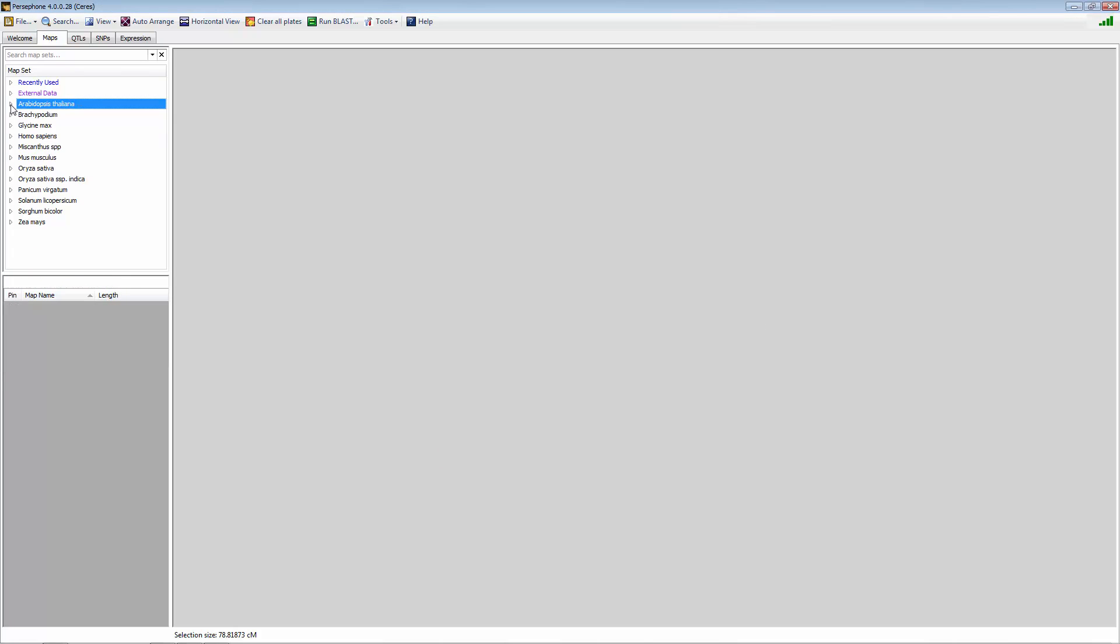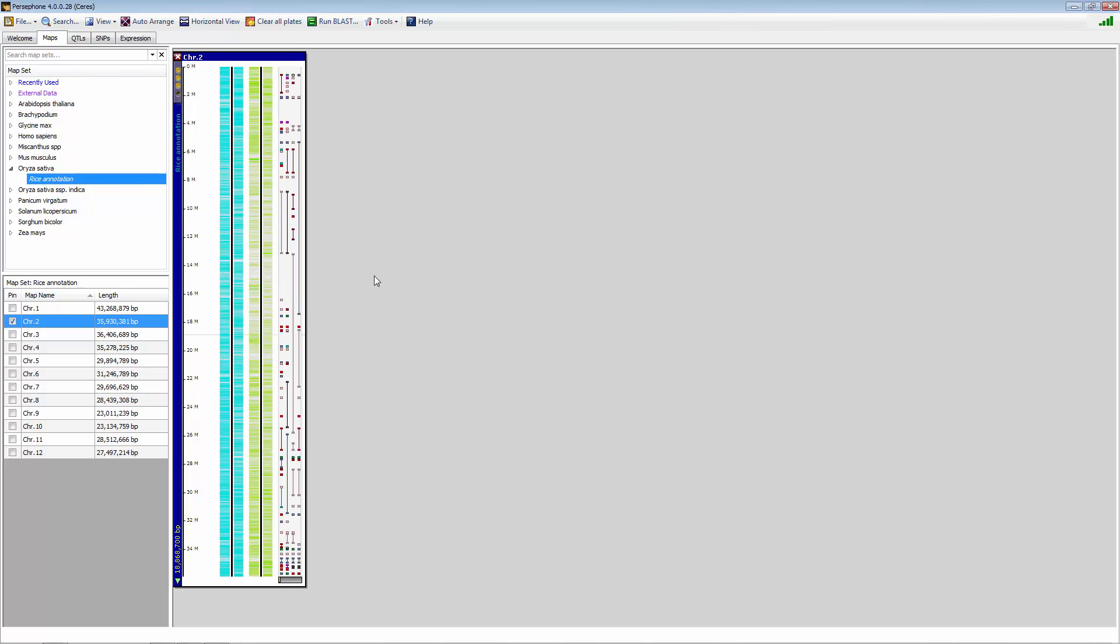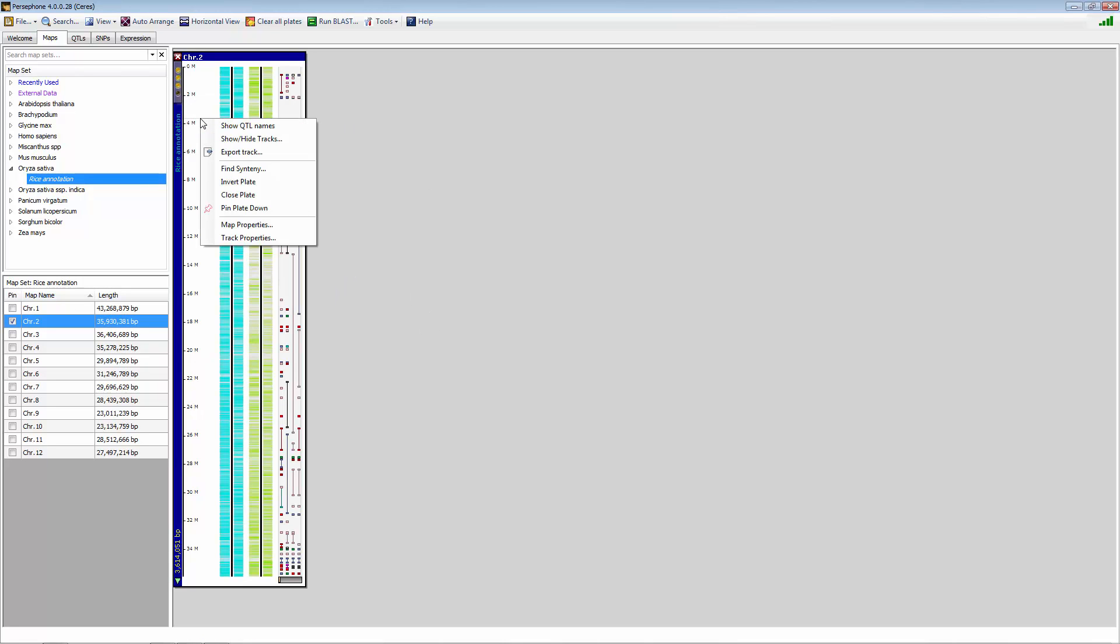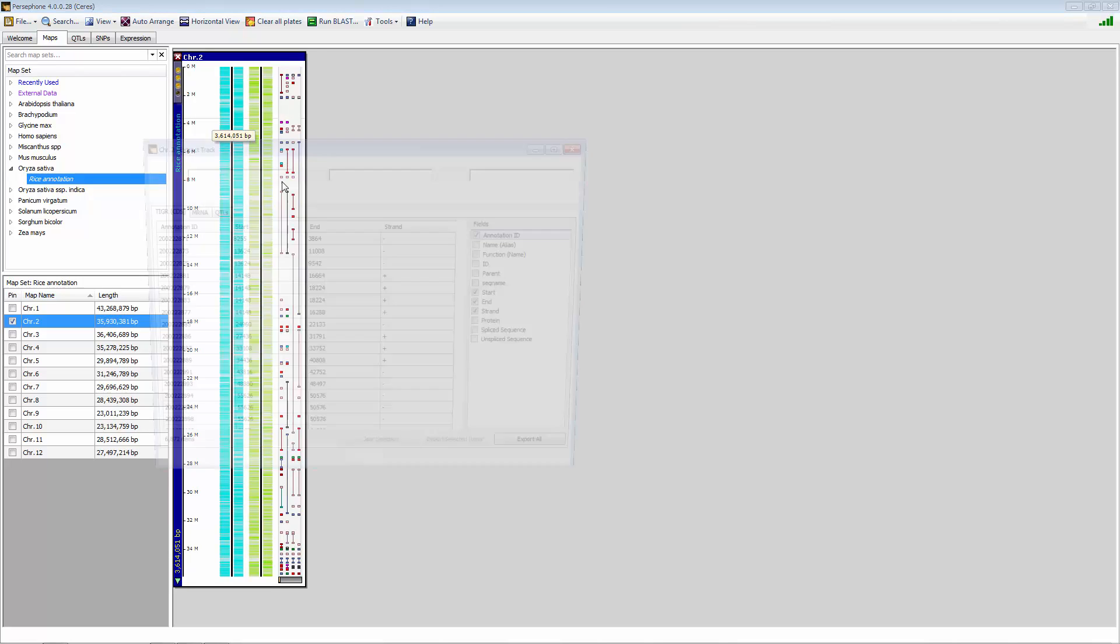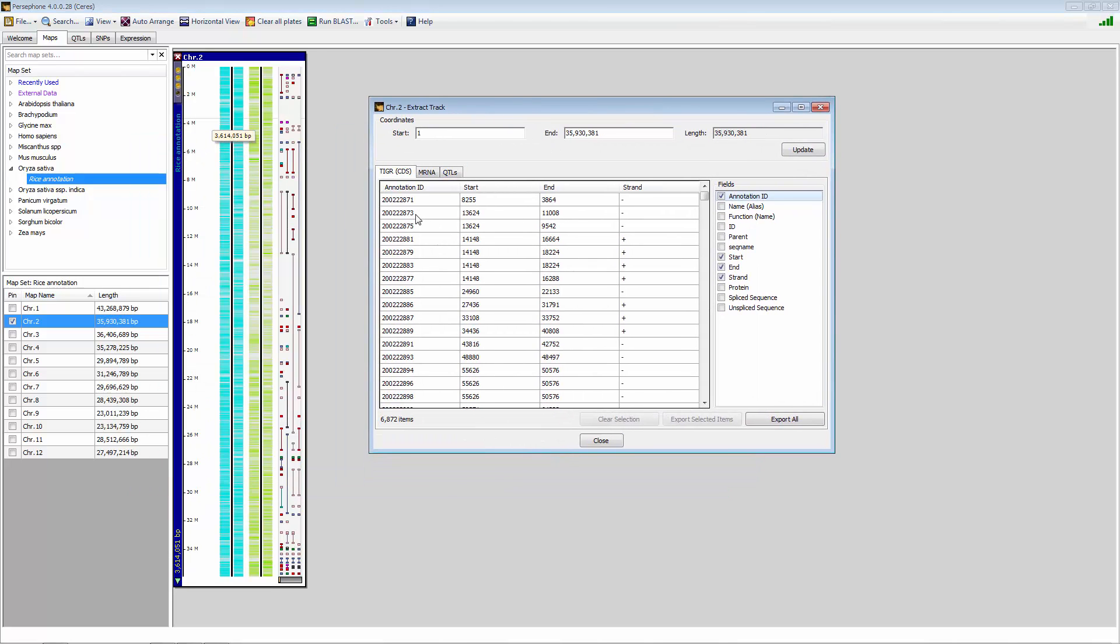The more common way to export is to actually select a chromosome. So in this example, we have chromosome 2. Once again, if you right click on the entire chromosome, you can actually export chromosome 2 and all the genes on chromosome 2, once again, for all the different tracks.